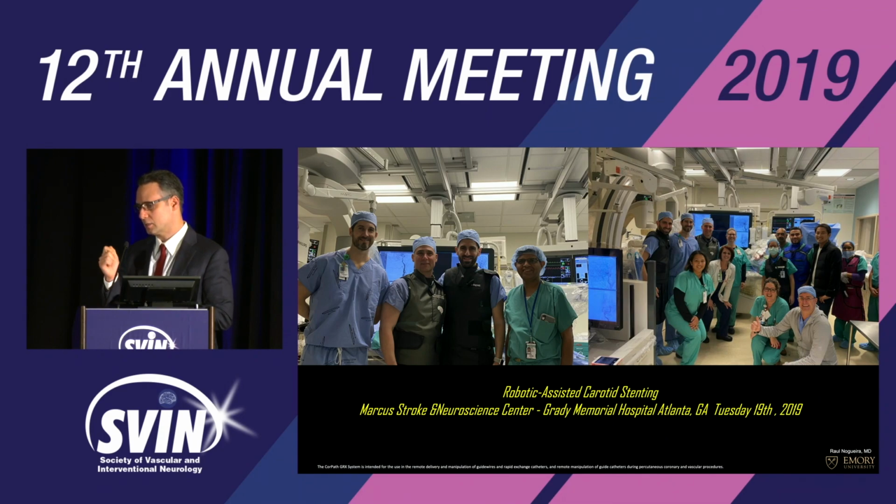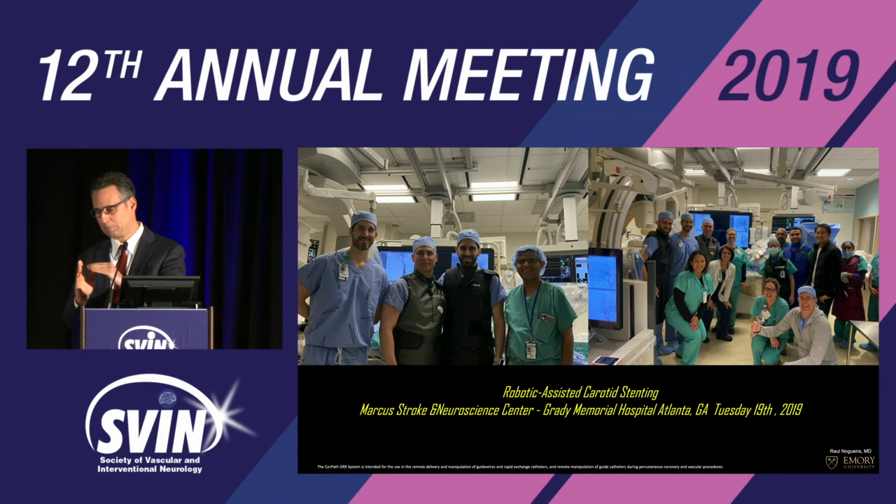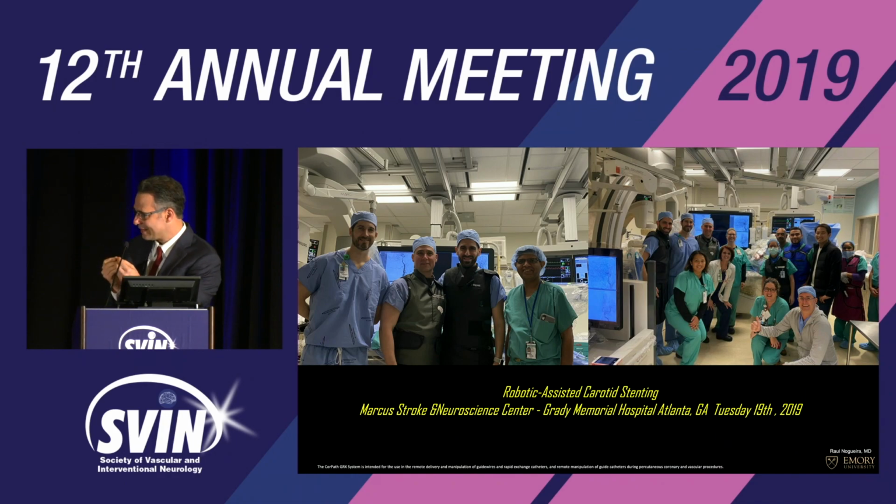And there are certain tools, for instance, the ability that once you advance the wire, when you come back, it torques in a different direction. So I think specific for small aneurysms, you can go in the branch, come back, and it will essentially jump inside into the side aneurysm. So the finesse of the movement, if it's not right now better than human, it will be very soon better than human. It's very, very millimetric movements you can adjust, and the torque ability is also spectacular.